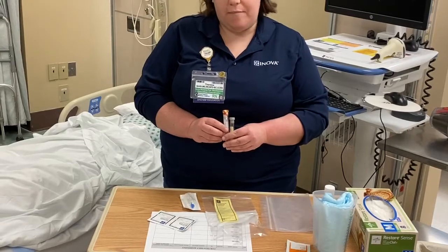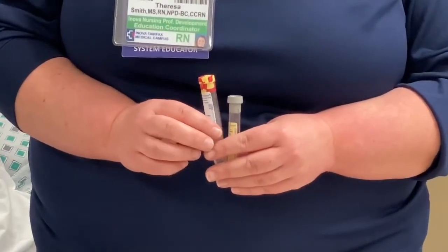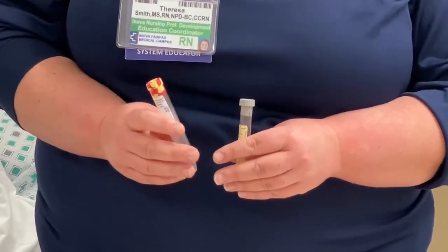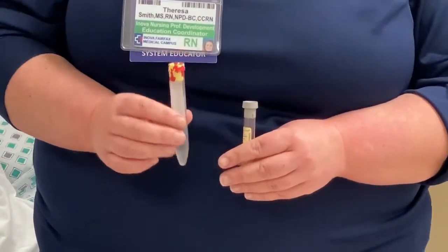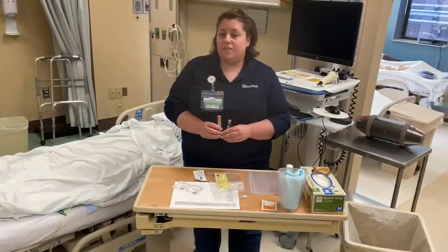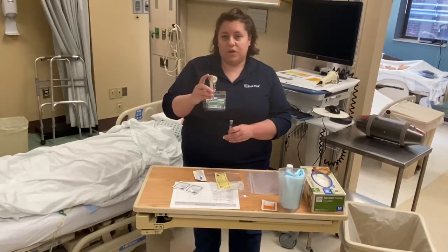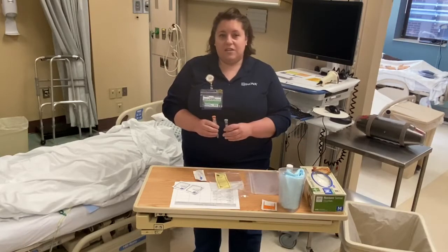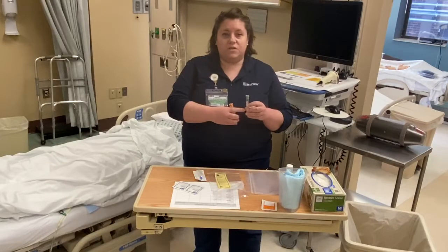What will normally happen is that the physician will first order a urinalysis for the patient. A urinalysis is basically an analysis of the patient's urine, and it can tell the physician a lot of things about the urine. It can also tell them if bacteria is present. However, it does not tell the physician what type of bacteria. So when a urinalysis, which goes in this yellow and red tube, comes back as positive for bacteria, the physician will then order a urine culture, which goes in this gray tube.